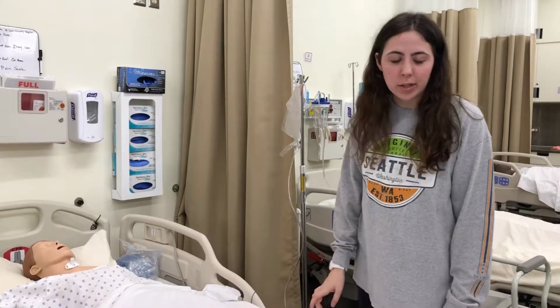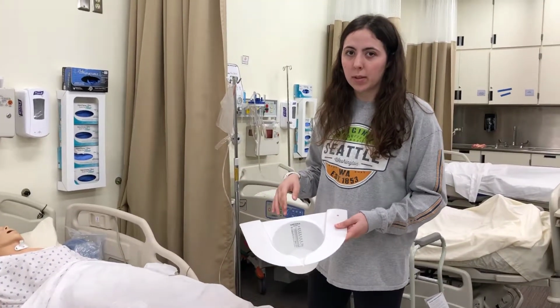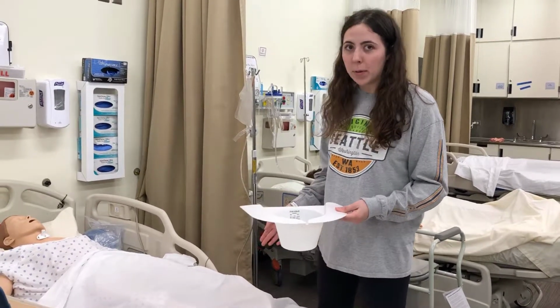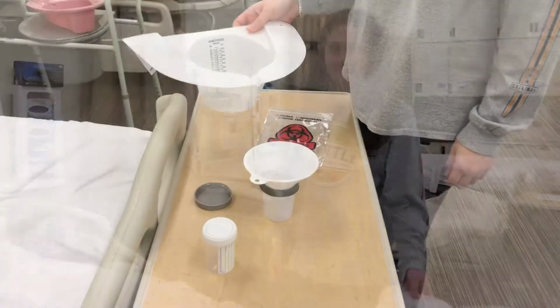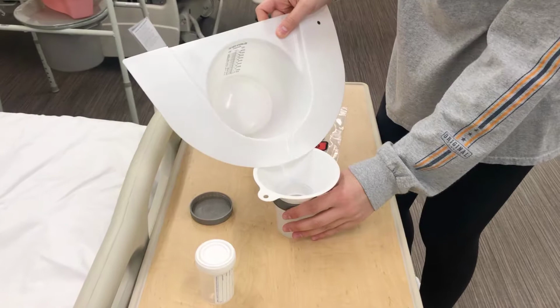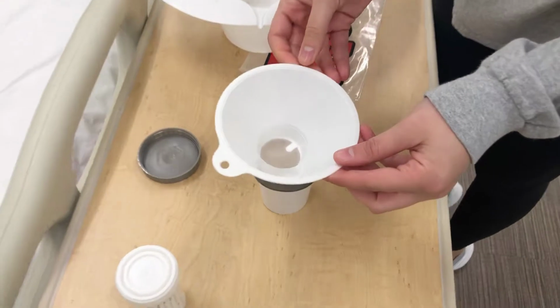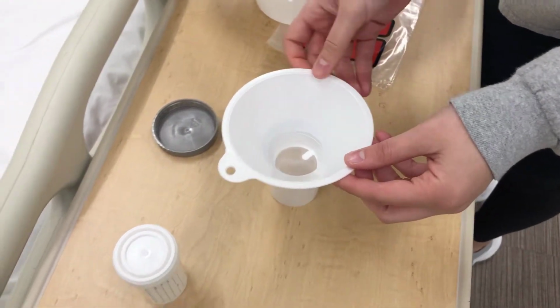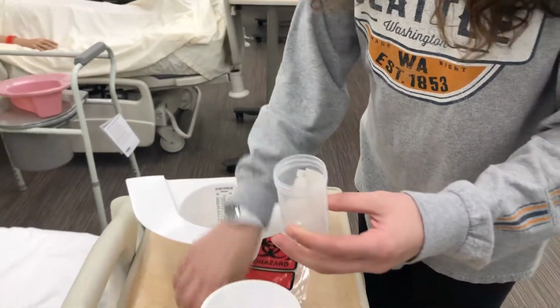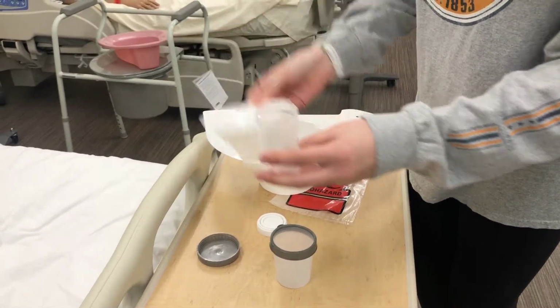So this is a clean procedure, and since the patient is mobile, they can use the urine hat. This would just go in the toilet, and then I would have them urinate in it and notify me when they do so I can collect it. Once I've collected the urine, I would take it into the funnel and collect all of the urine. Any kidney stone would filter into this. Then I would use another container and take any stones and put them into there.